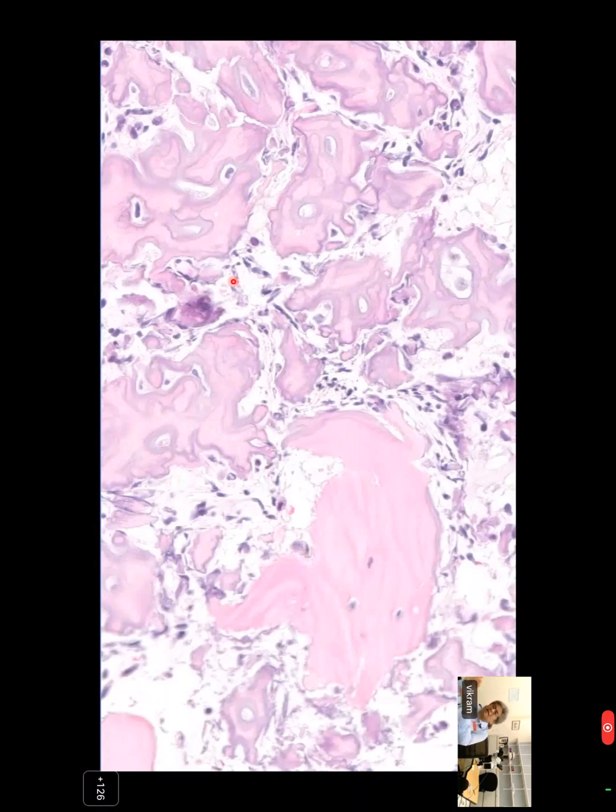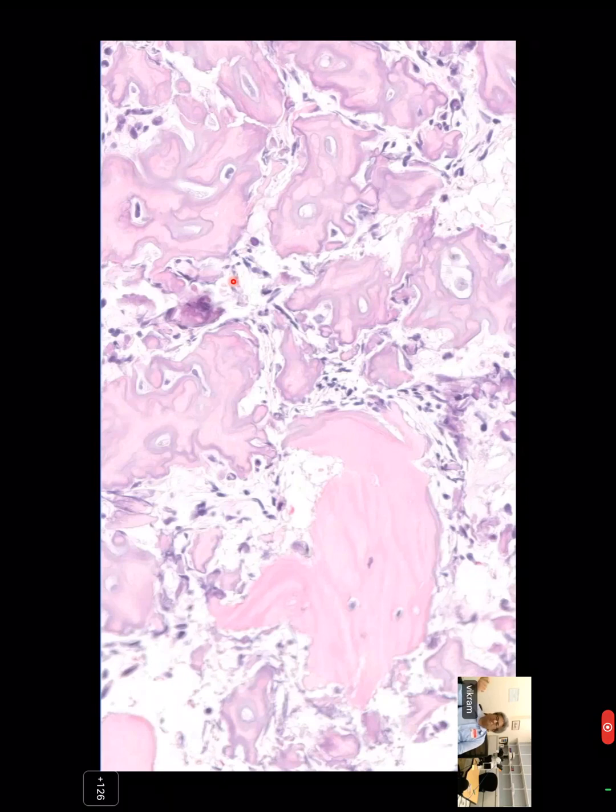You know, there's a whole class of osteosarcomas that are very bland, and that's parosteal and intramedullary well differentiated osteosarcoma. But then there are also high-grade osteosarcomas that can start looking low-grade because of this normalization phenomenon. So this is not a grade 1 osteosarcoma. Remember, grade 1 osteosarcomas generally do not get chemotherapy. This is actually a high-grade osteosarcoma with very bland nuclei because of normalization.